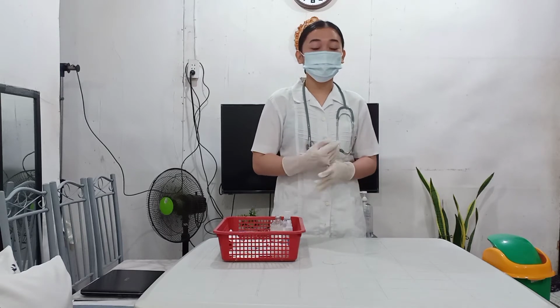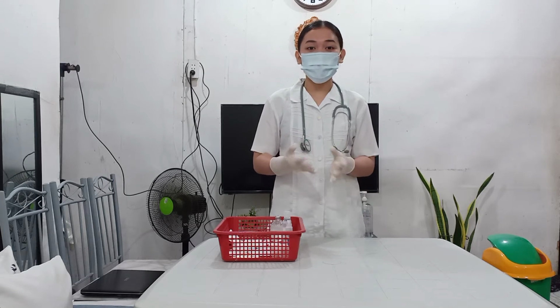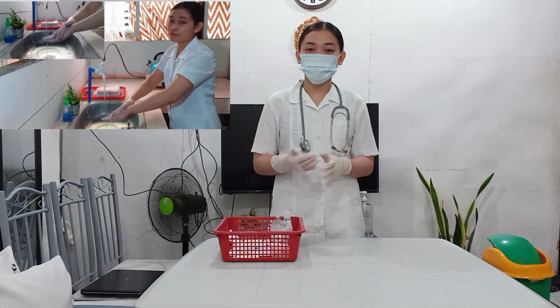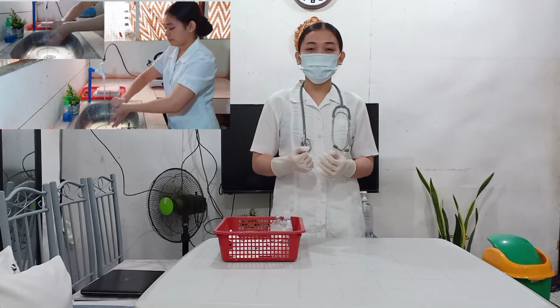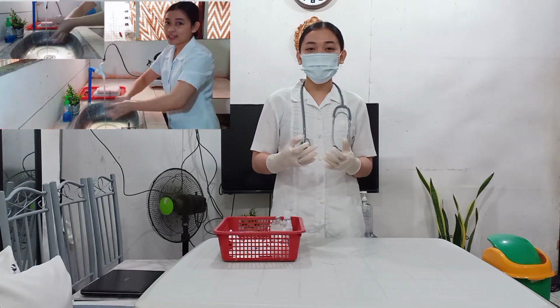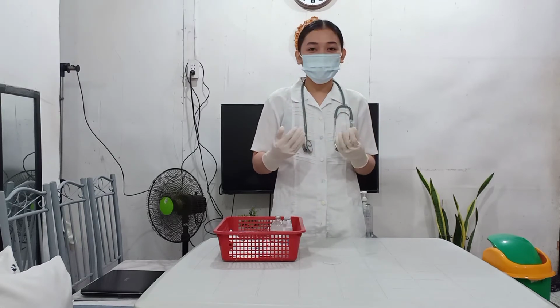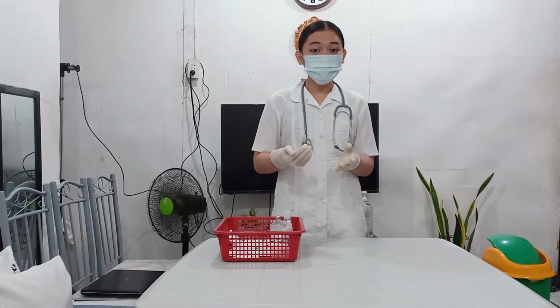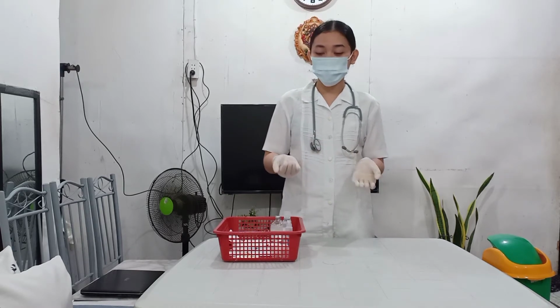Now, let's proceed with preparing medications from ampules. First is to perform hand hygiene and observe other appropriate infection control procedures. This is to prevent contamination and possible transmission of microorganisms. I've already washed my hands and donned my gloves. Now, let's proceed to the second step, which is to prepare the medication ampule for drug withdrawal. Organization of necessary items for the procedure facilitates accurate performance.